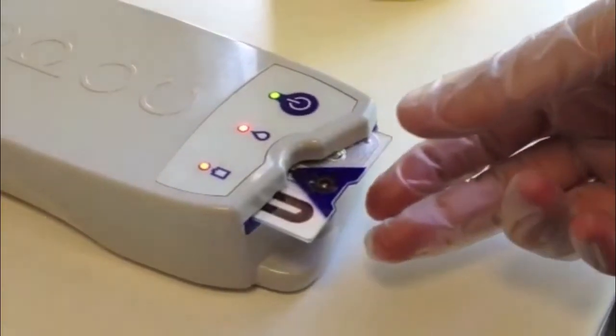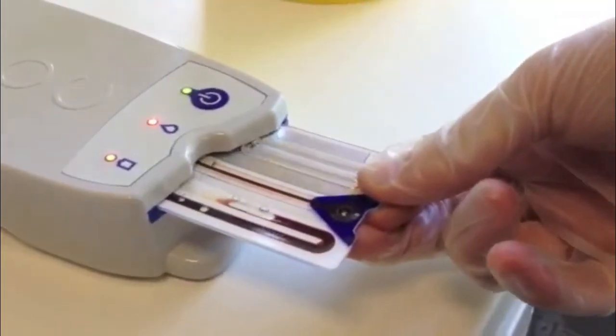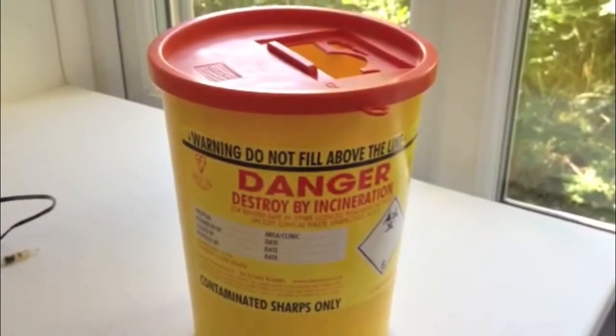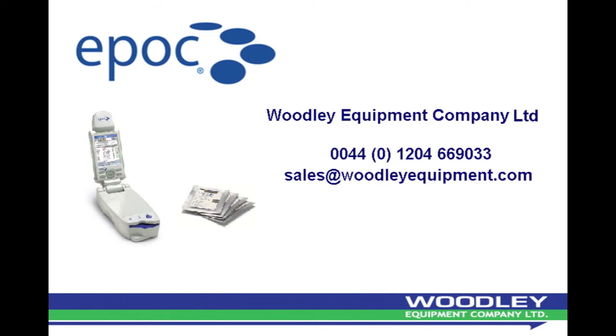On completion of the test, the card should be removed from the analyser and discarded into a clinical waste container. Thank you for listening.